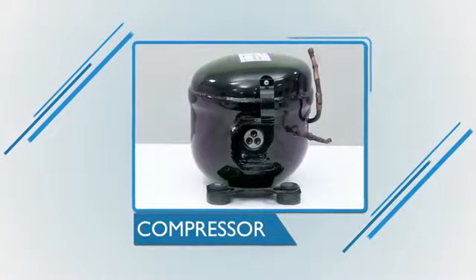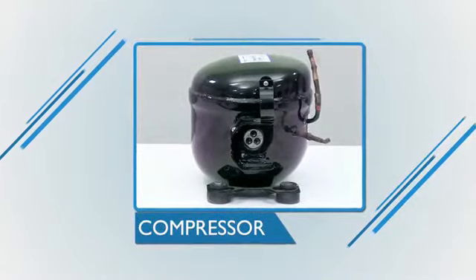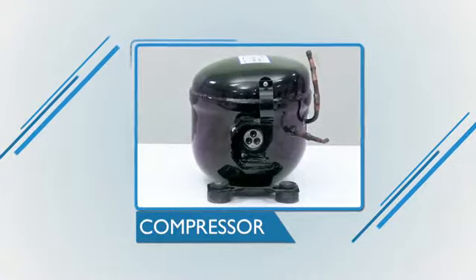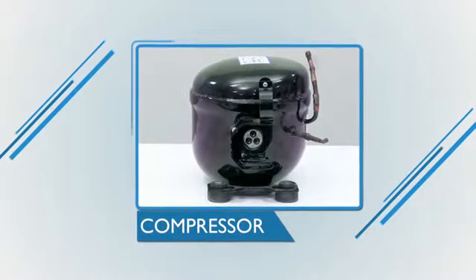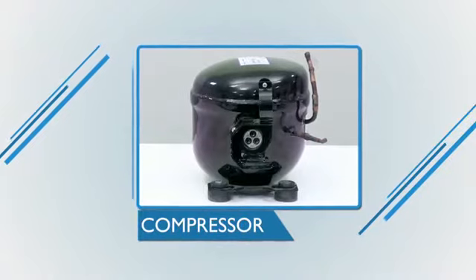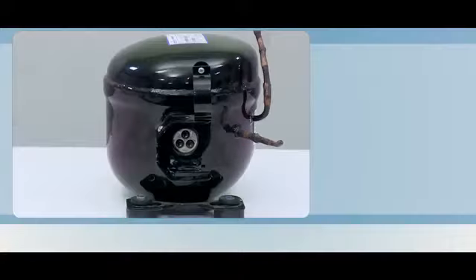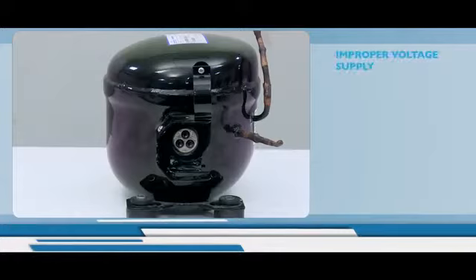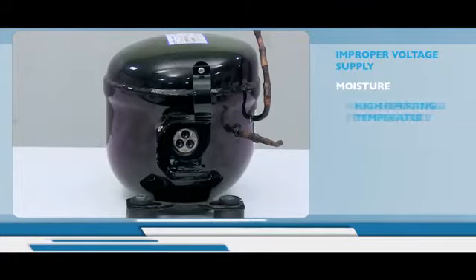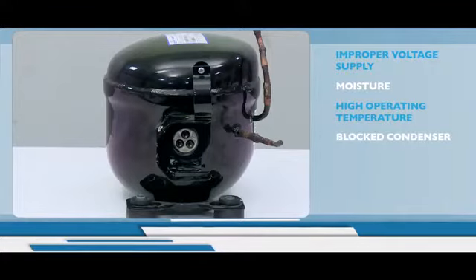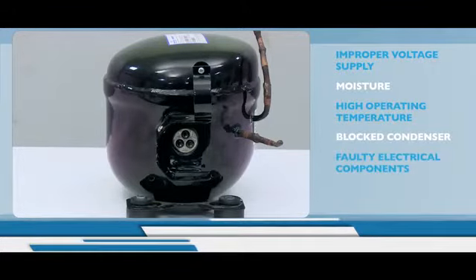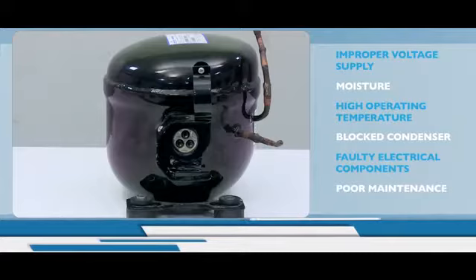Now let's talk about a compressor. In ice-lined refrigerator and deep freezer, commonly used compressors are of reciprocating type and hermetically sealed. This is a reciprocating type and hermetically sealed compressor. Compressor generally fails due to improper voltage supply, moisture in the system, high operating temperature, blocked condenser, faulty electrical components and largely due to poor maintenance.